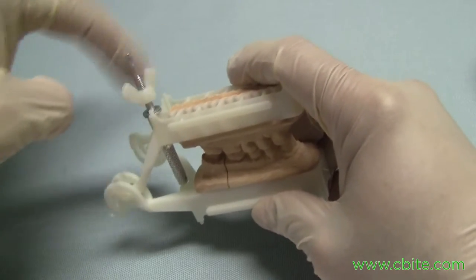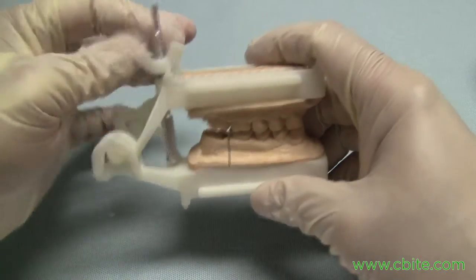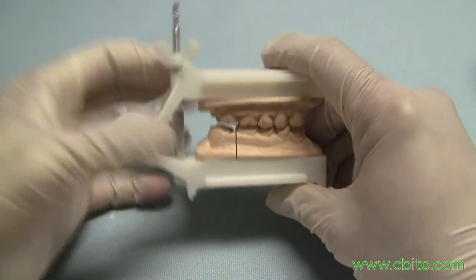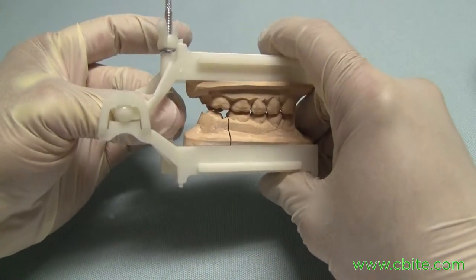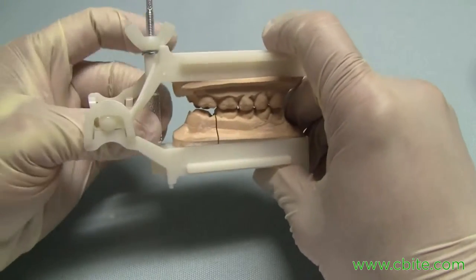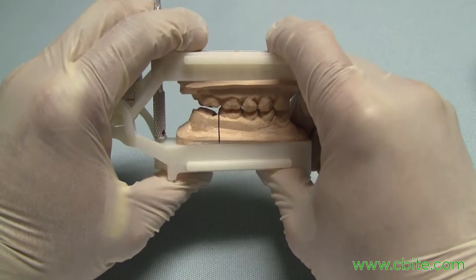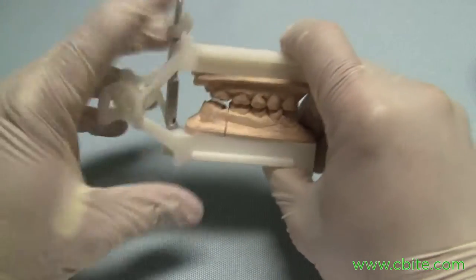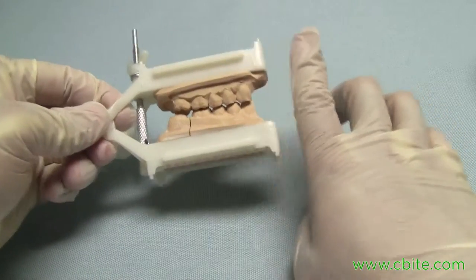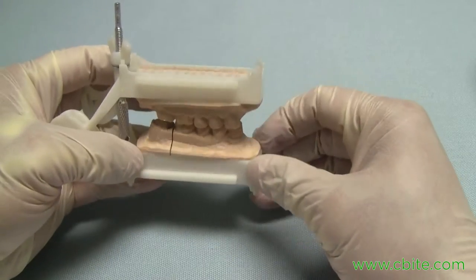Remember, the backstop pin — also called the incisal pin, which is the same thing — is a reusable accessory, so make sure you don't throw it away; you can keep reusing it. If you need it as an incisal pin, just move it up front because there are holes up there too. Just make sure you don't have stone over that membrane when doing so.